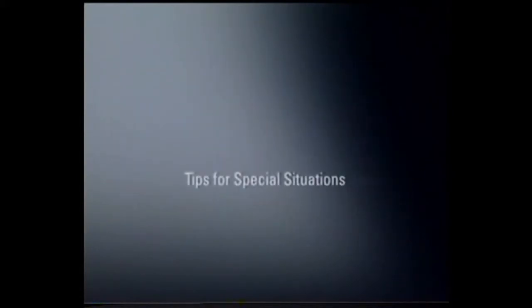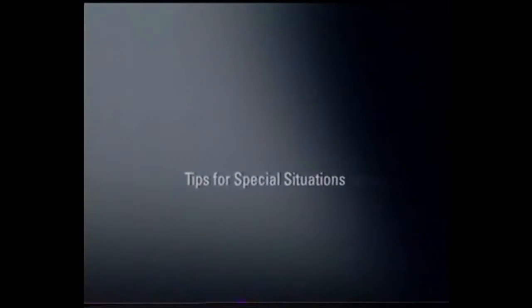Check responsiveness. Call out for help. Call 911 and get the defibrillator. Check the patient for breathing and signs of circulation. If absent, start CPR. Turn on the defibrillator and follow the voice prompts. Here are some tips for special situations.